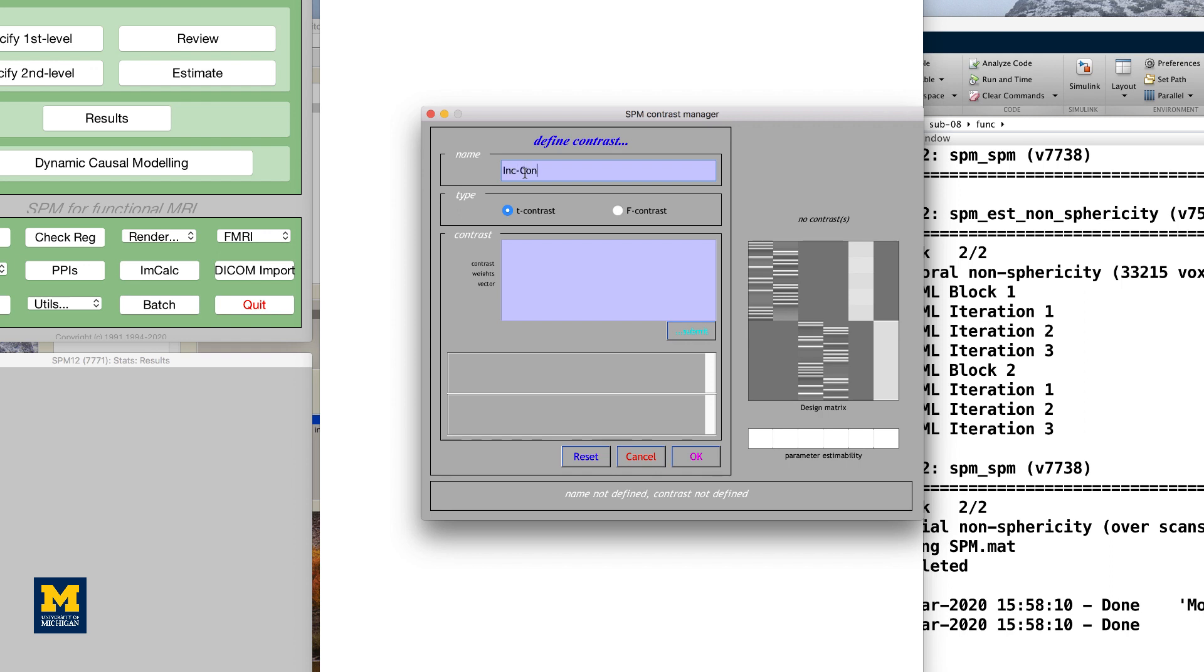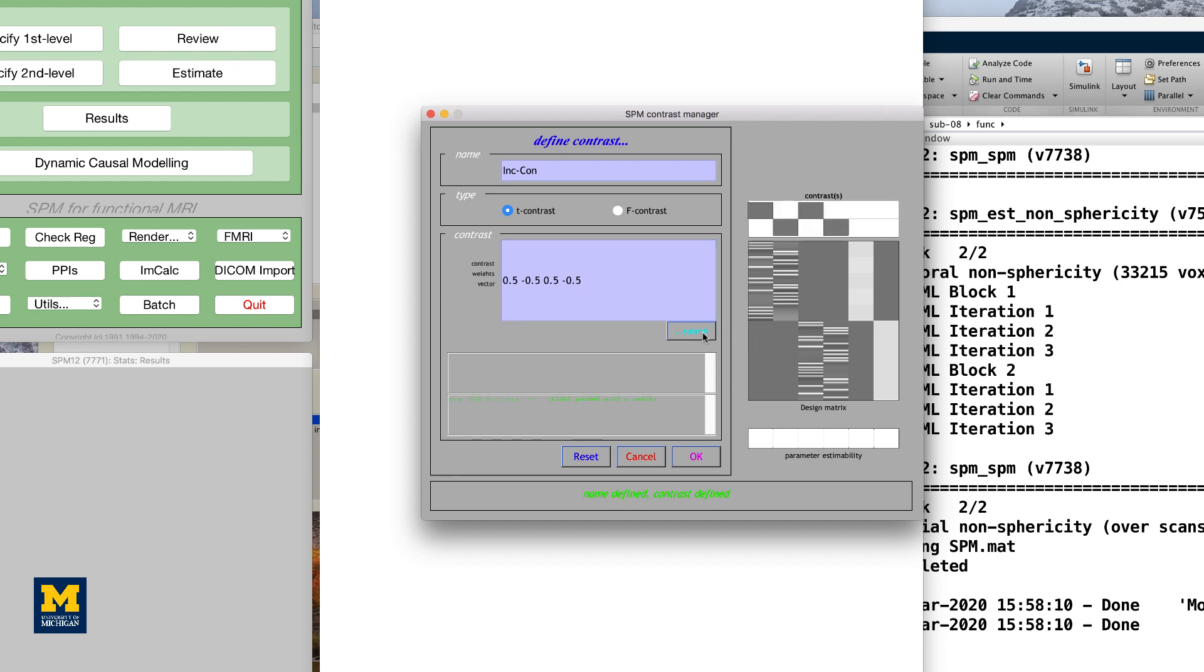Then, in the Contrast Vector window, type 0.5 -0.5 0.5 -0.5, and then click Submit. If the contrast is valid, you should see green text at the bottom of the window saying Name Defined, Contrast Defined. Make sure that your contrast manager looks like the figure below, and then click OK to create the contrast.